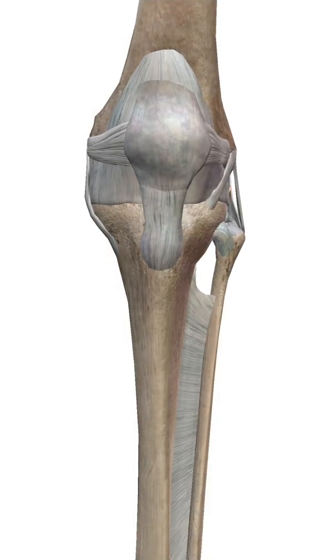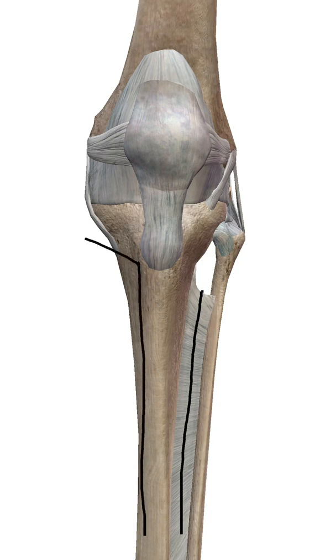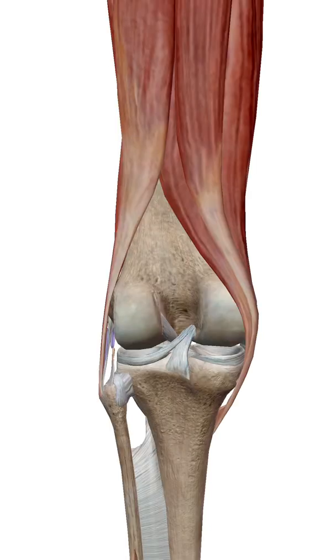The main parts of the anatomy that you're going to be wanting to pay attention to are the interosseous groove located between the fibula and the tibia, the medial tibial flare, the patella tendon, the proximal edge of both the medial and lateral epicondyles, and the insertion points of the hamstring tendons posteriorly. All of these are going to be really important during the casting process, so even before you get started you need to be palpating your patient's limbs and knowing where each of these are and what they feel like.